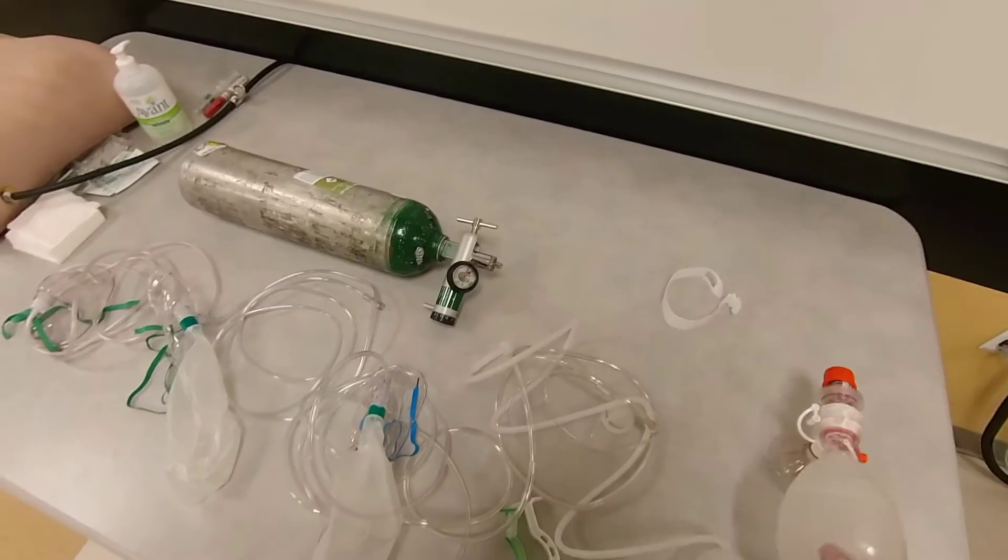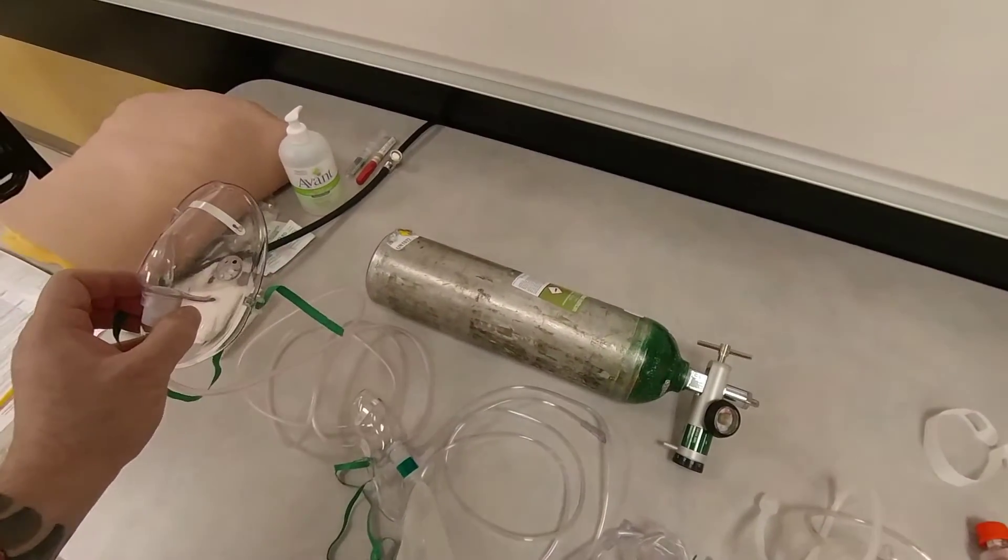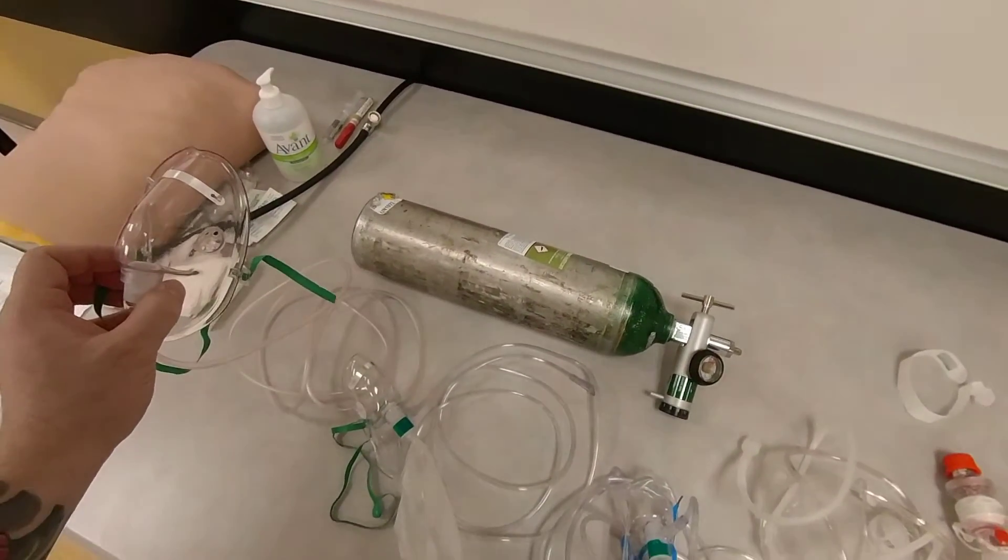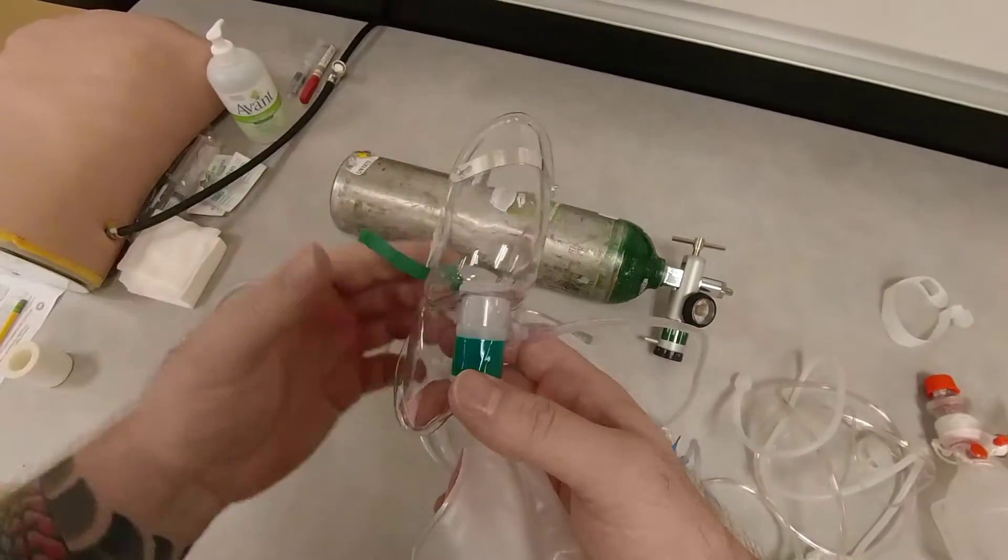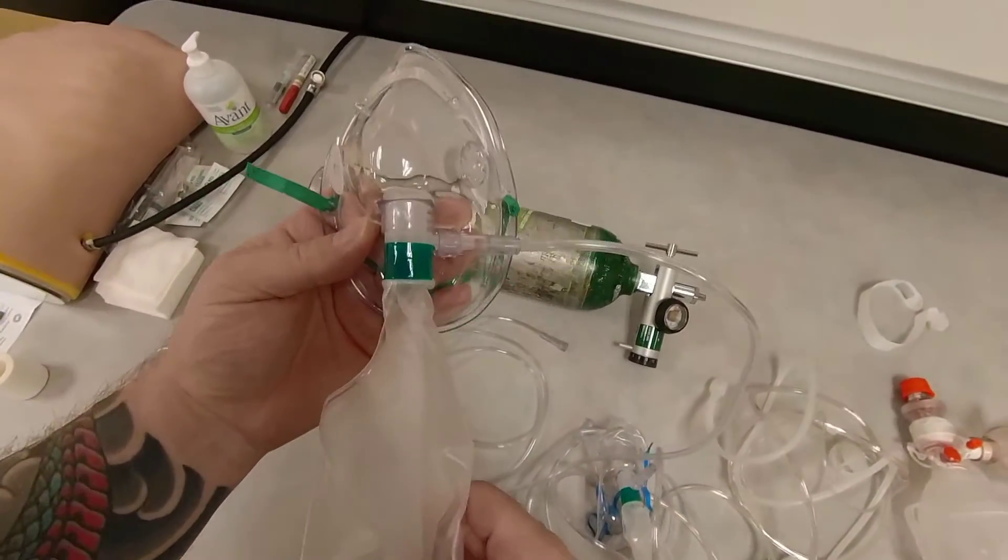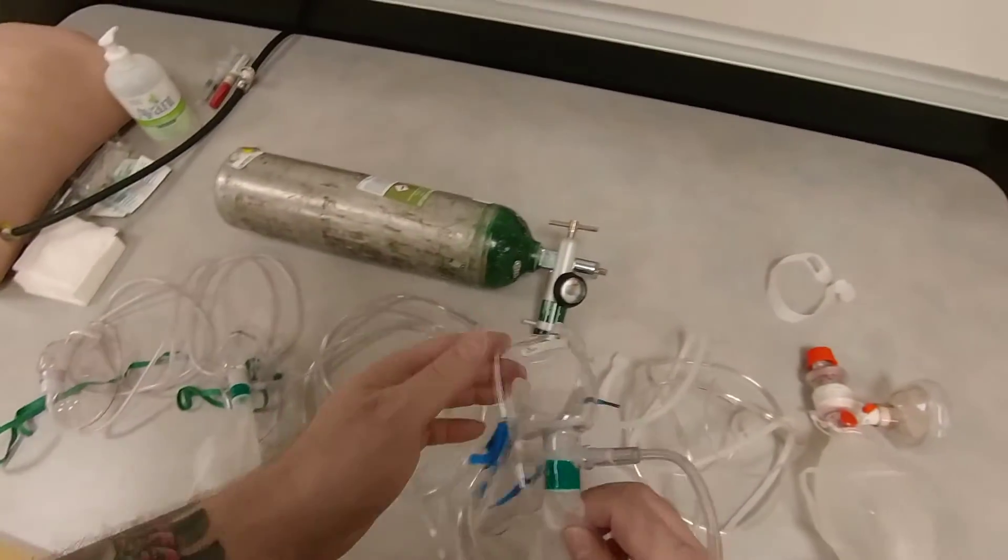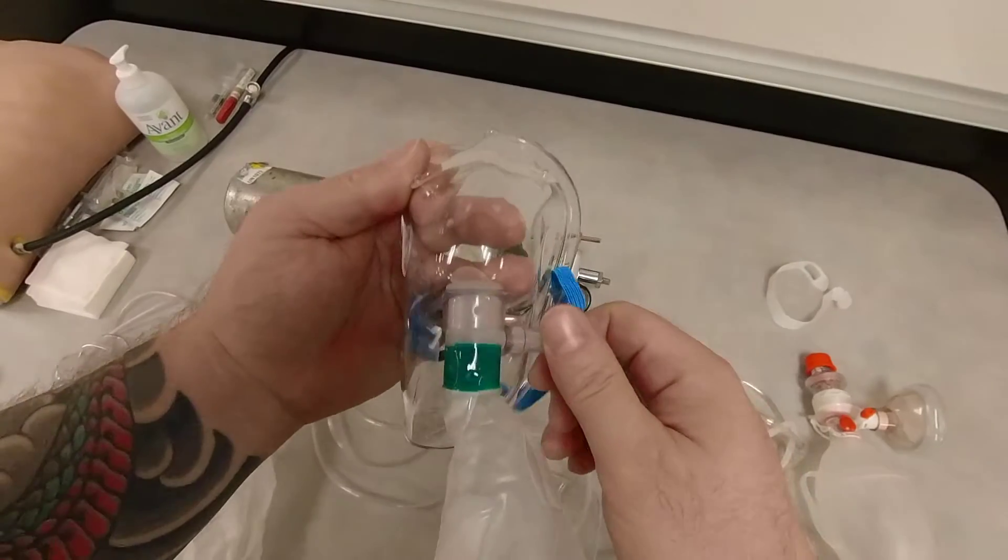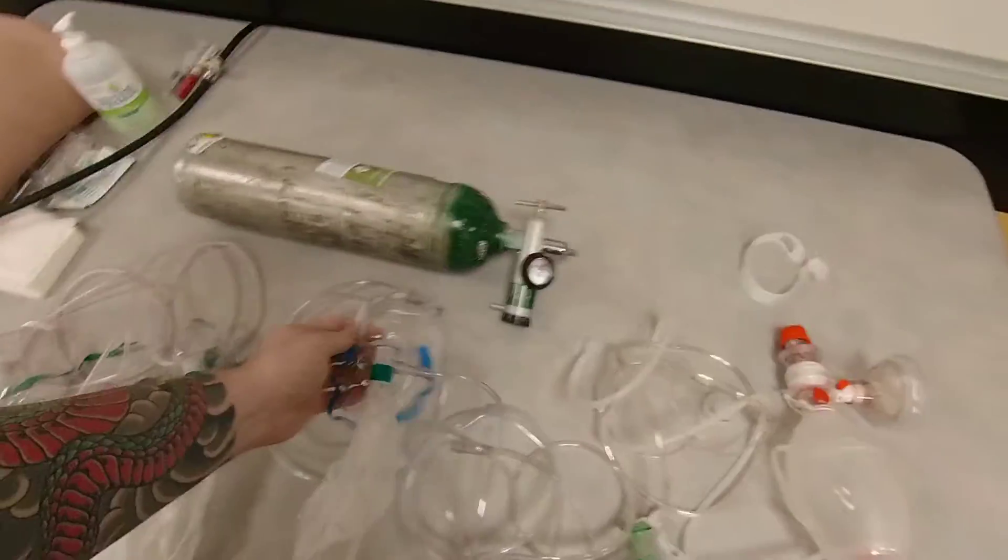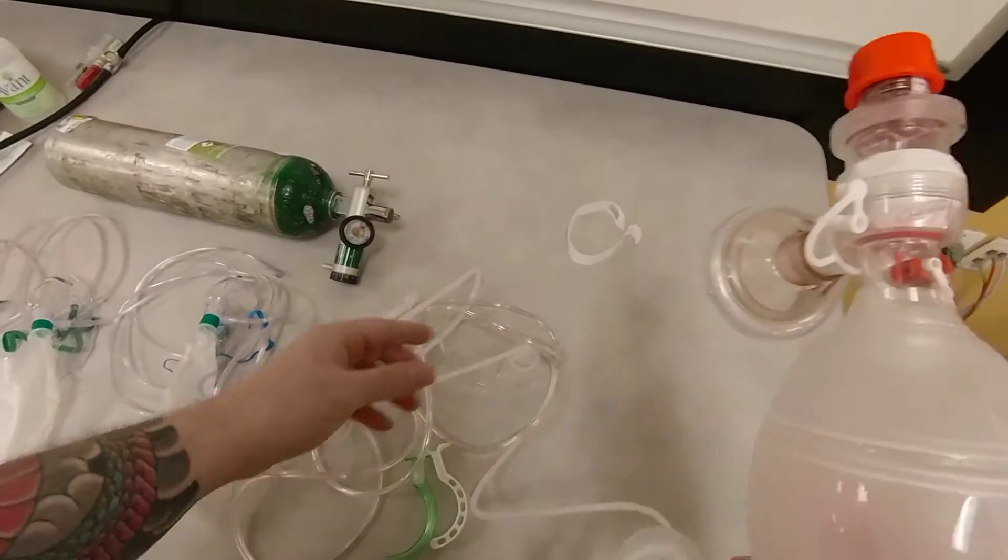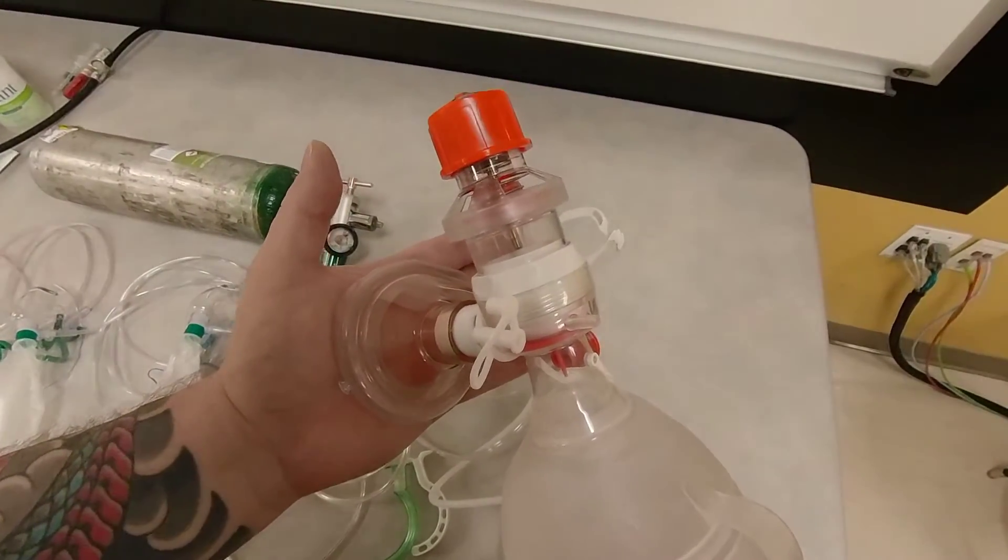Those two concepts are not the same. So just to summarize, simple face mask at 15 liters per minute gives you about 50% FiO2. A non-rebreather mask, which is false non-rebreather mask with a safety valve, gives you about 70% FiO2. And a true non-rebreather mask, if the patient has good minute ventilation, gives you about 90% FiO2. And BVM at 15 liters per minute will give you greater than 90, close to 100% FiO2.